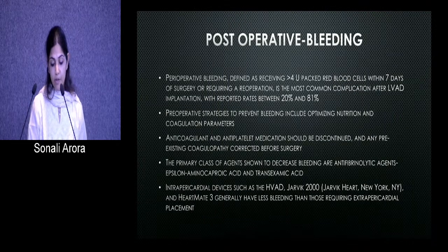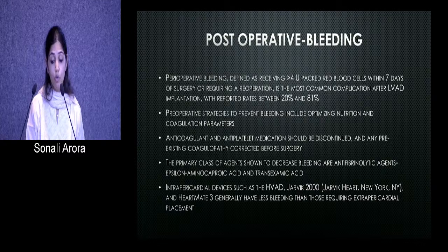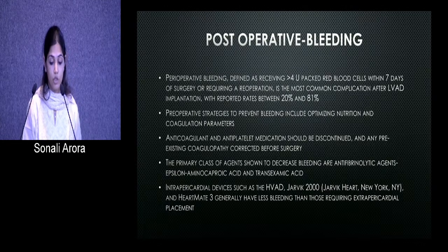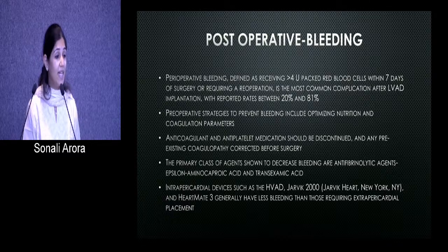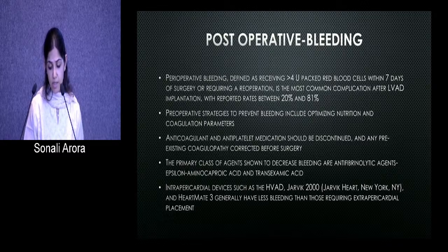So post-operative bleeding is defined as receiving more than 4 units of packed red blood cells within 7 days of surgery or requiring a reoperation. It is the most common complication after LVAD implantation, with reported rates between 20 and 81%. Preoperative strategies to prevent bleeding include optimizing nutrition and coagulation parameters. Anticoagulant and antiplatelet medication should be discontinued and any pre-existing coagulopathy corrected before surgery. Usually epsilon aminocaproic acid and tranexamic acid, which are antifibrinolytic agents, are used to reduce bleeding.